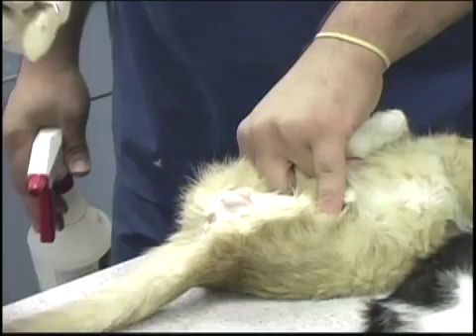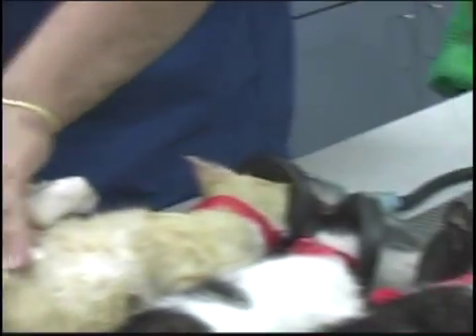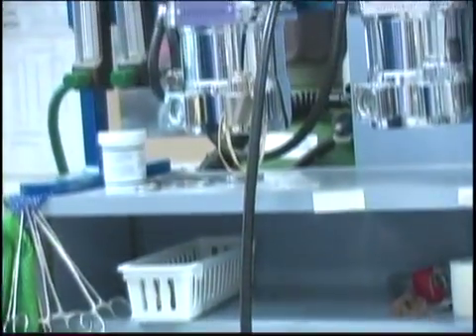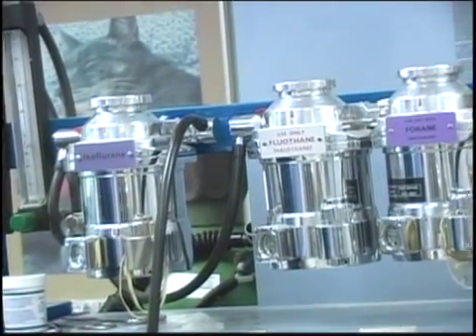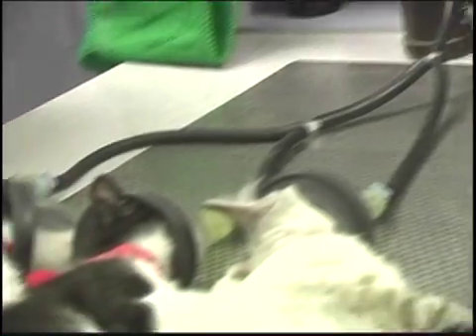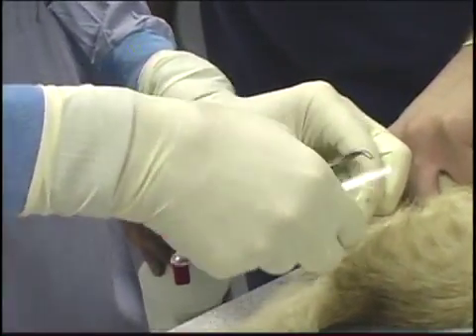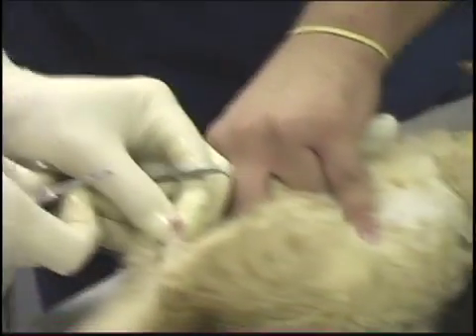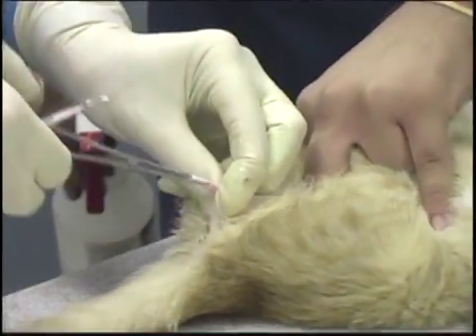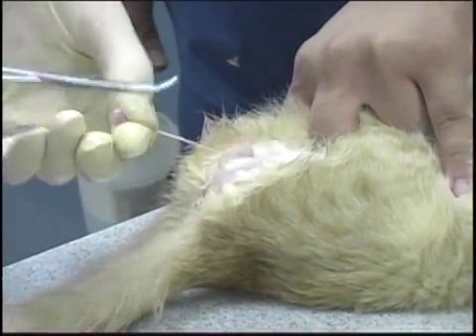What we have here is our special hookup. We have four little males. They've been injected with ketamine — just enough to get them to where they can't move around a whole lot — and then they've been placed in their respective masks and gassed down with isoflurane. I have a special manifold here where I can split off my gases and deliver it to several at the same time.